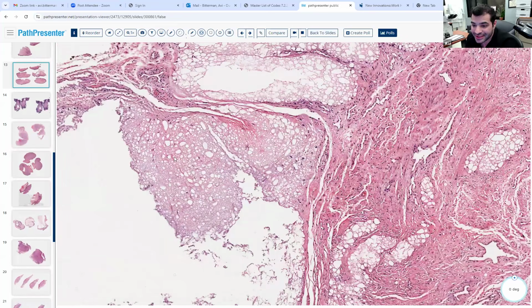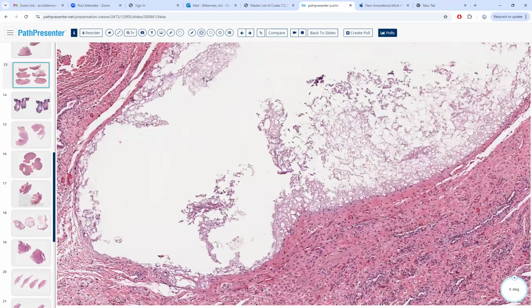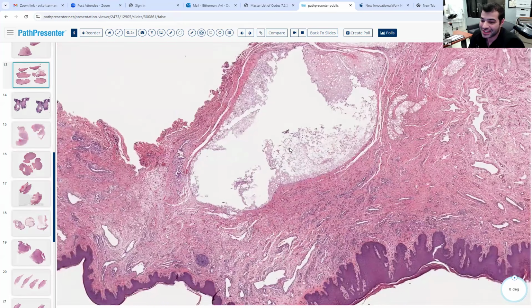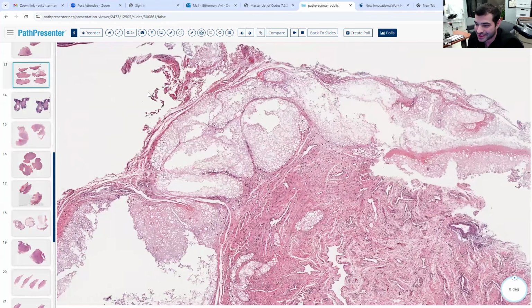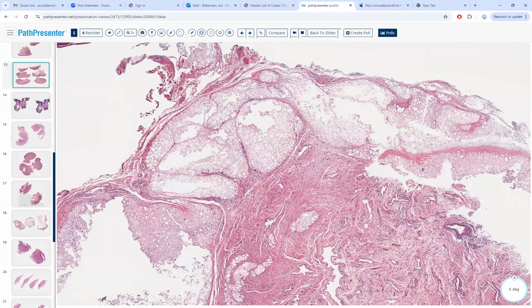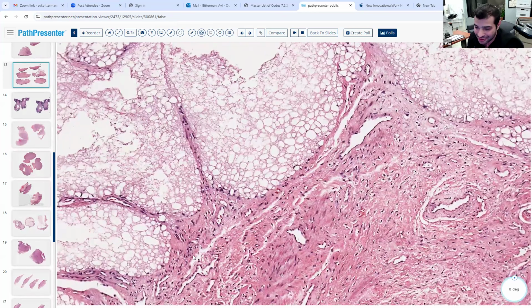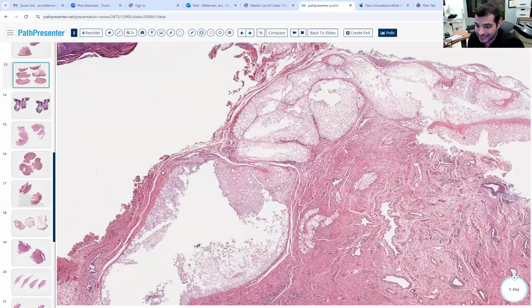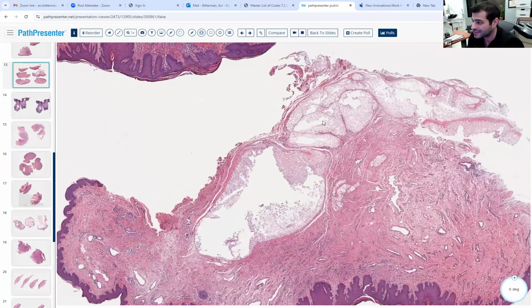You mean silicone, right? I was thinking of silica granuloma. Well, it's actually interesting because do you see much of a granuloma here? You would think with something foreign like this, you would get a granulomatous reaction, a big reaction. You don't really see that. It's the wimpiest thing ever. Maybe some cells are trying, but not really. There's not much of a granuloma, and not a whole lot of inflammation for something where I would expect an enormous amount of inflammation for this type of foreign body.